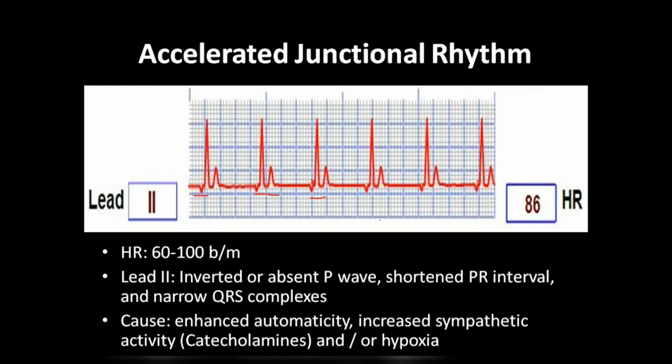So after one ventricular contraction, it will overlap with the next ventricular or the atrium contraction. That's why we get an accelerated rhythm.